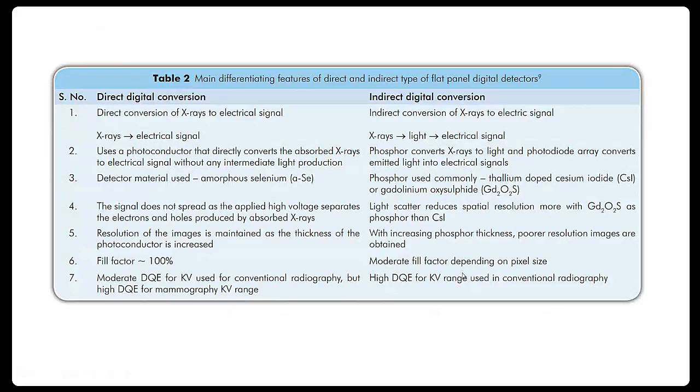So what is fill factor? Fill factor is the area of the detector that is sensitive to X-rays compared to the total area of the detector.